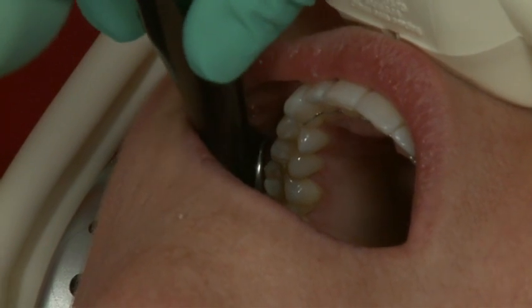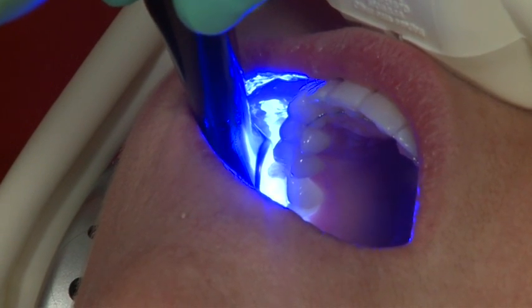The Velo is awesome when it comes to access. It fits pretty well anywhere. That head is so small and nice — we can get it in the smallest, tightest little corner usually with no problem.